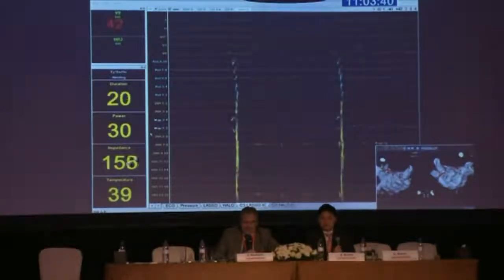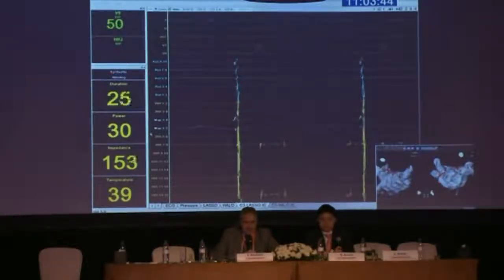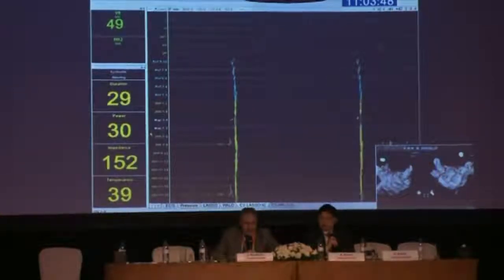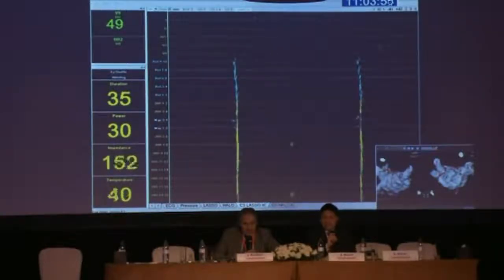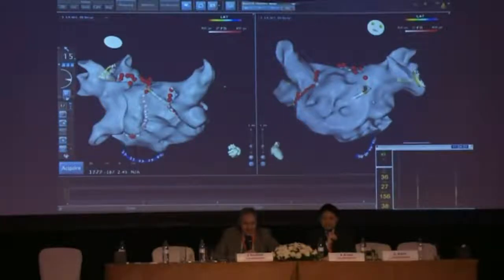Very interesting. It was the activation that drove me to that site. And it's a bit cheaper than Topera. Can we see now the map to be able to localize exactly the spot? Bigger map, yeah, please. So we need your glasses, Richard, to be able to see these rotors instead of having expensive mapping systems. Very impressive.